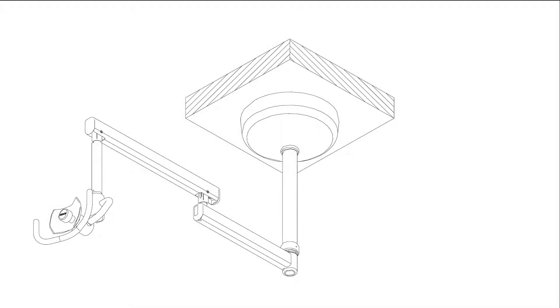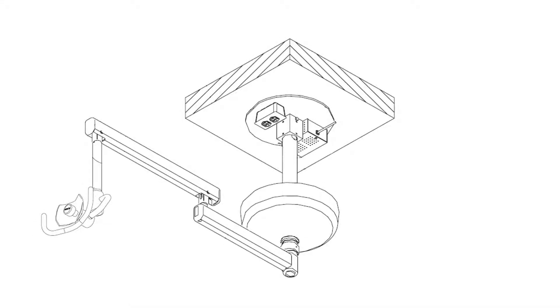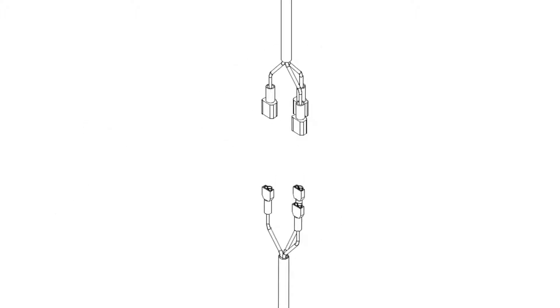For ceiling mount lights, remove the ceiling shroud and locate the break in the light wiring harness. Disconnect the light wiring harness by pulling the 3 mated spade connectors away from each other.